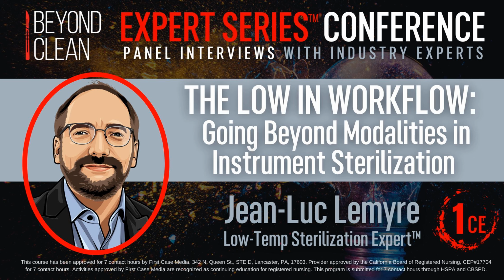Thinking between the two modalities, in steam you still have some limitations about weight in the chamber and how densely you pack it, but it seems much more forgiving in that regard, because we have this nonstop high pressure saturated steam that gets everywhere in the chamber. With hydrogen peroxide sterilizers, we have to be a lot more careful about how we load, because we have to make sure that the sterilant can reach everything, and that there's an appropriate amount of sterilant to reach all of the surfaces. Would you say that summary is correct? Yeah, I would say this is correct. I'm less familiar with steam in general. I would not advise not following the recommendation.